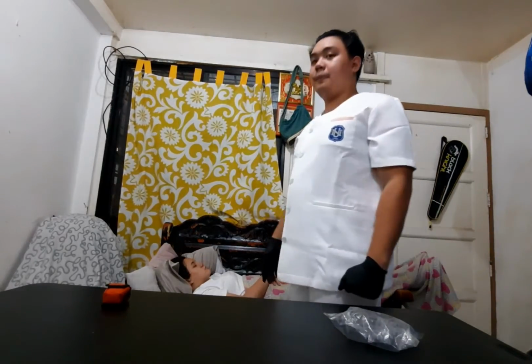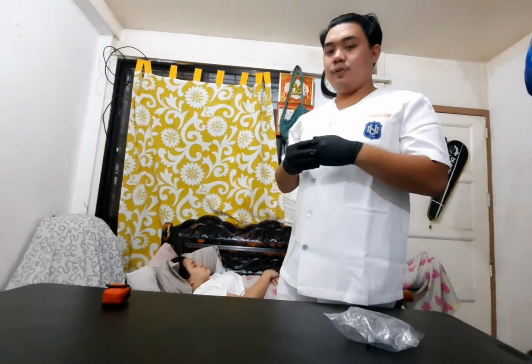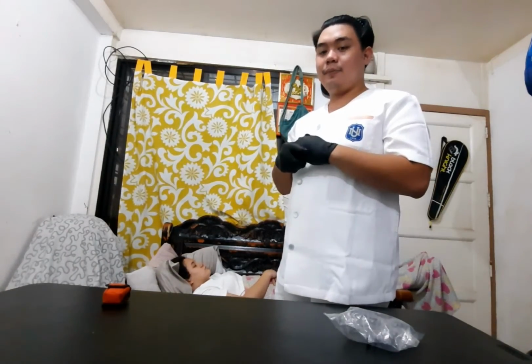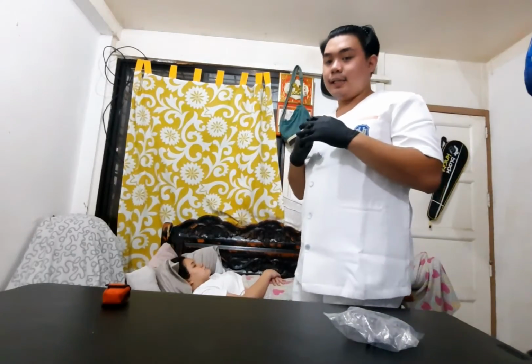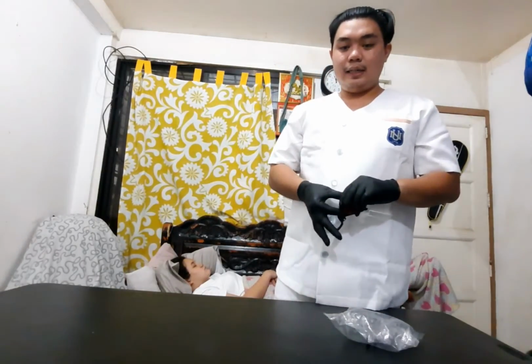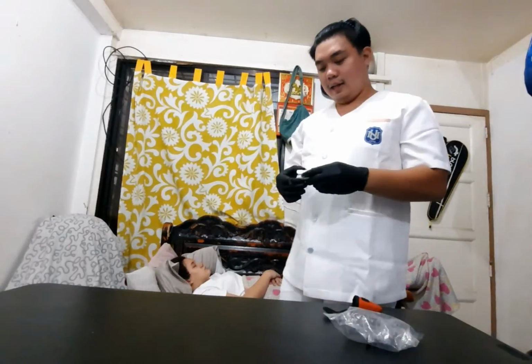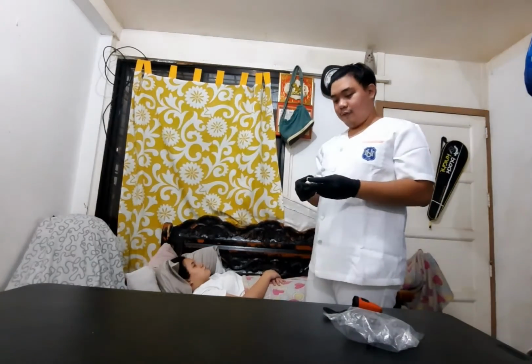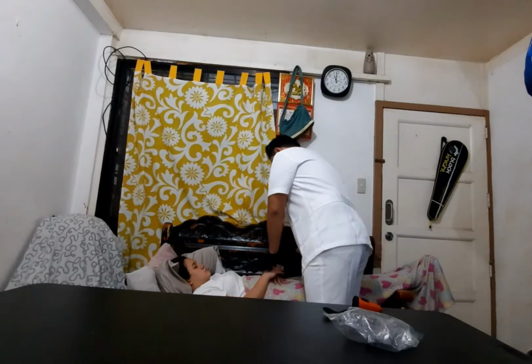After securing the nasal cannula to the nostrils of the patient, dispose of all waste materials properly, and then assess the patient's vital signs, level of anxiety, color, and rate of respiration, and provide support while the patient adjusts to the device, and attach the pulse oximeter to monitor the oxygen saturation of the patient.